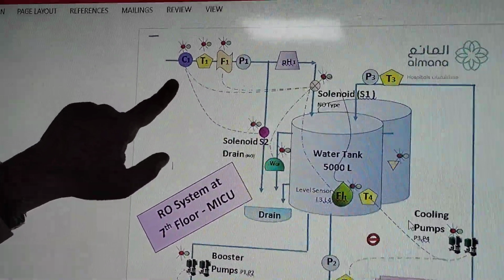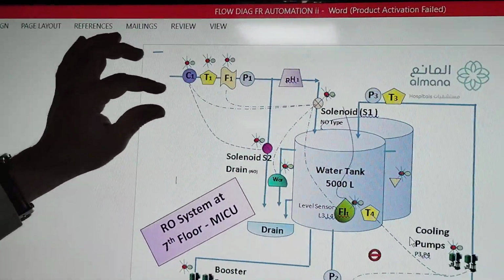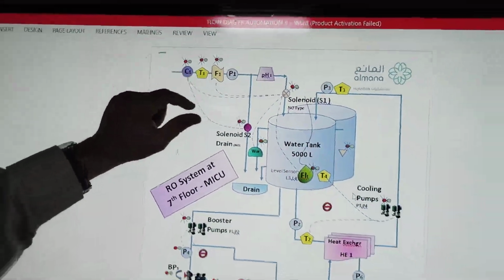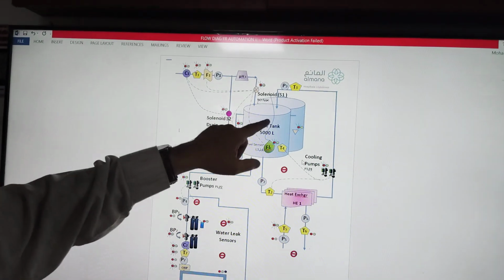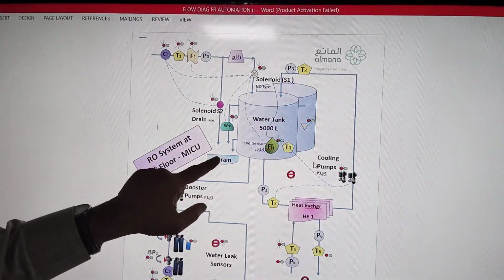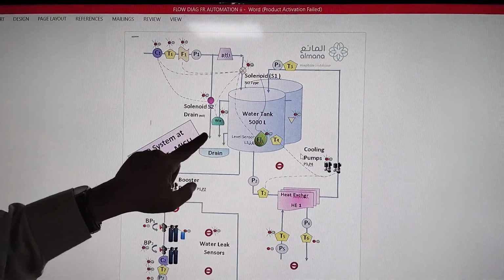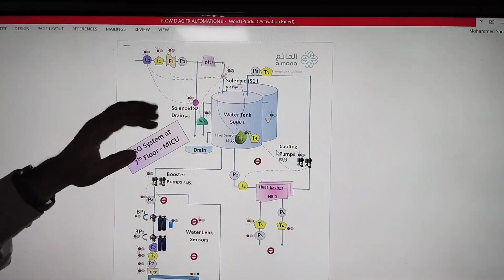One is the conductivity sensor. The conductivity sensor will monitor the quality of the water. If the quality is not good, meaning it is not within the conductivity limit, it will not allow the water to go into the tank. Instead, it will allow it to go into the drain. It will drain the water until the quality of the water is good. It will flush the water out.